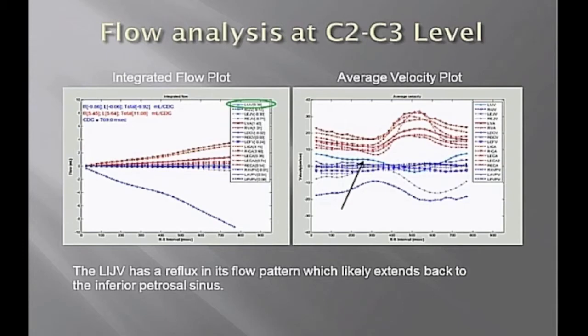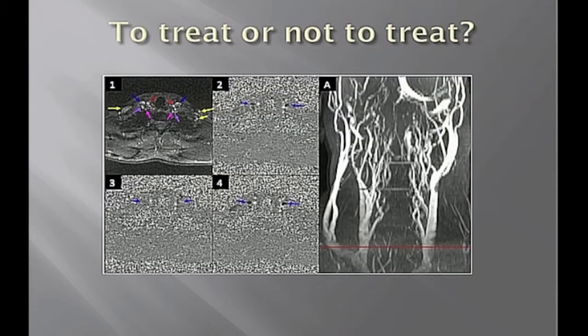Here, we would need even higher resolution. We use 1/2 by 1/2 millimeter just to do the internal jugular veins. We would probably have to push that to 1/4 by 1/4 or something to do a good job on the petrosal sinus. But it may be possible to do that. So again, here's this characteristic single vessel draining the brain. Here's another case like that.